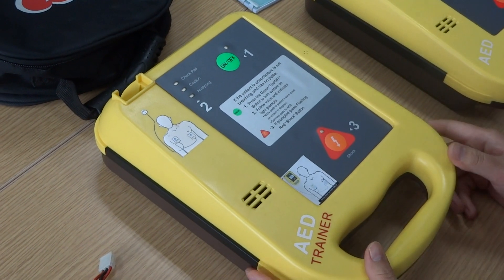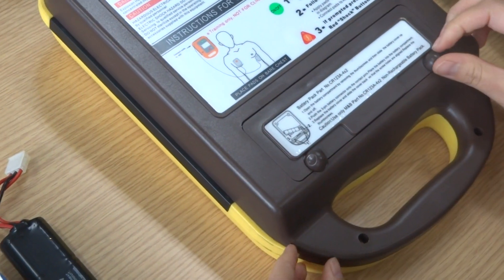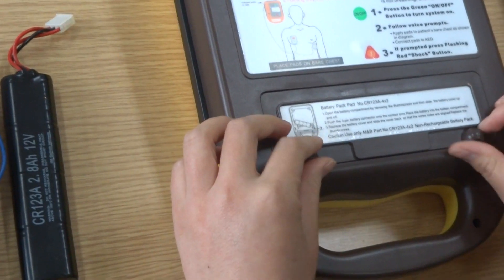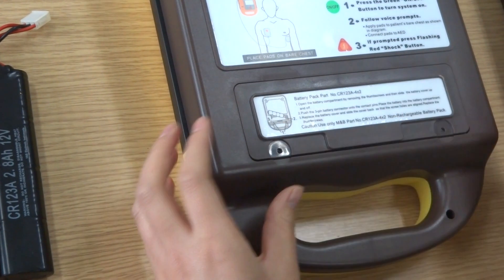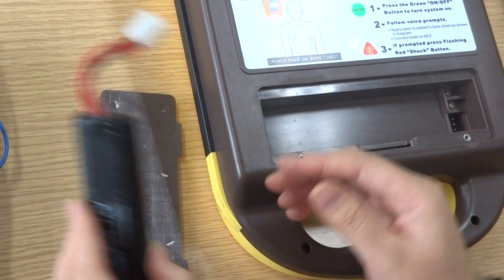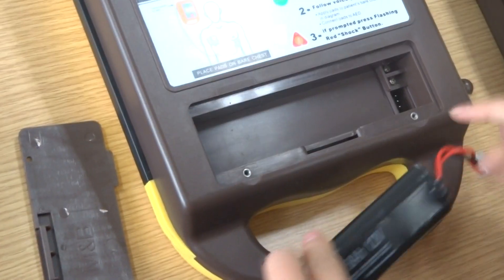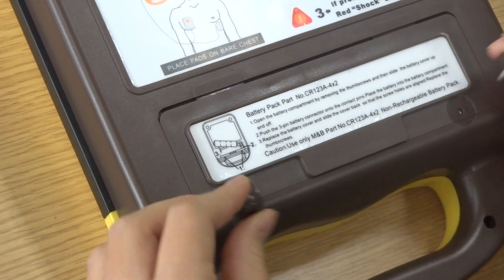Okay, let's start. First, install the battery. Open the back cover of the battery compartment, insert the battery, and then close the cover. Tighten these two screws.